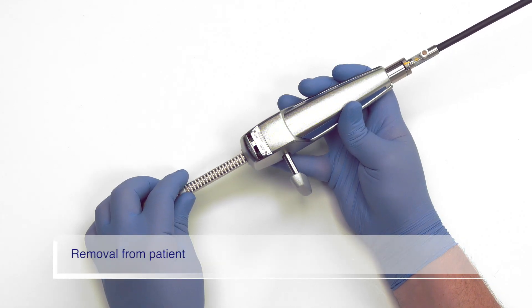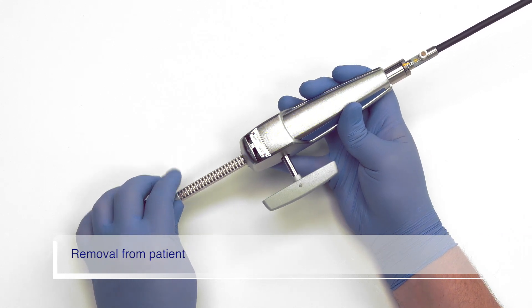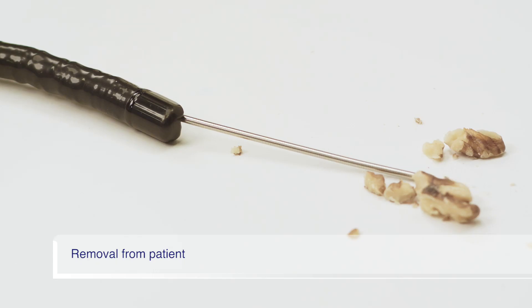When removing the basket from the patient, ensure the basket is fully closed. Also turn the ratchet off to relieve tension in the sheath. Then remove the basket from the patient.